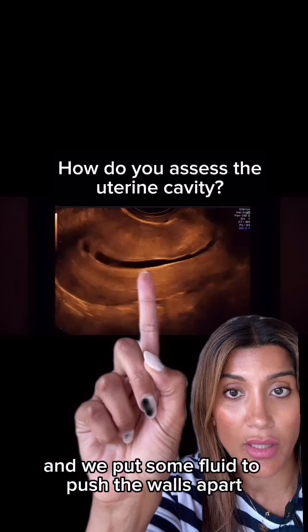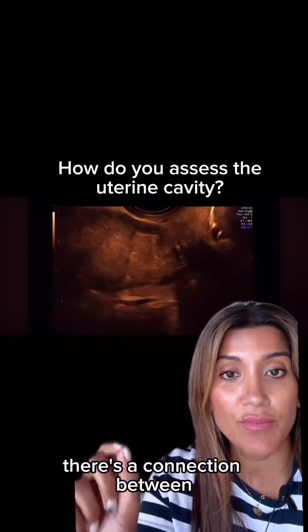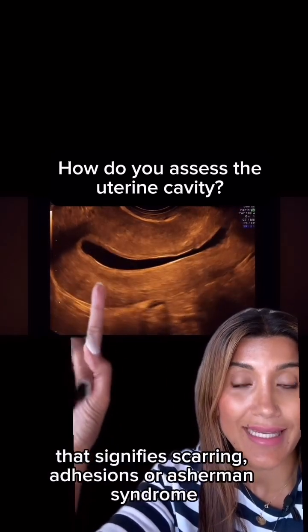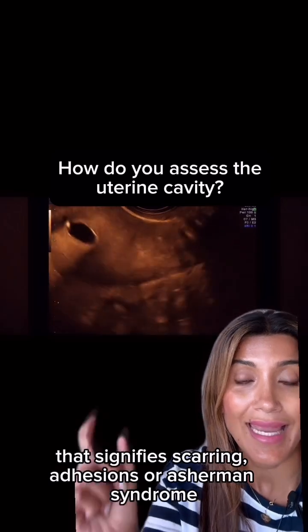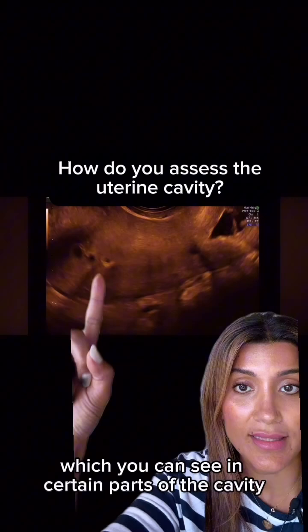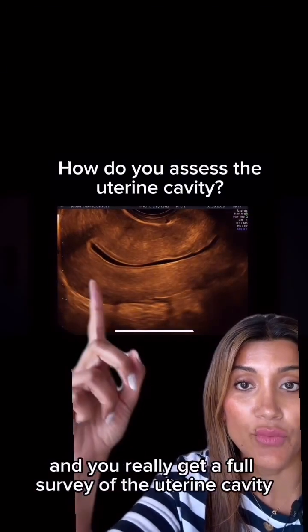When we perform a saline sonogram, we put a catheter through the cervix and we put some fluid to push the walls apart. And you should get this clear view, but you see these interruptions where there's a connection between one wall of the uterine cavity to the other. That signifies scarring, adhesions, or Asherman syndrome. And the cavity is interrupted and constricted by the scar tissue, which you can see in certain parts of the cavity as you sweep the ultrasound probe from one side to the next, and you really get a full survey of the uterine cavity.